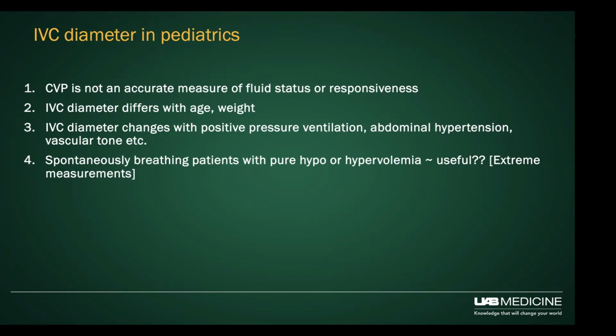If those patients have either pure hypo- or hypervolemia, in those cases, extremes of measurements, like an IVC that is negligible in size, completely collapsed, versus an IVC that is pretty large in size, I think I can make some judgment about the former being fluid down, dehydrated, hypovolemic, versus the other one being hypervolemic or fluid overloaded.